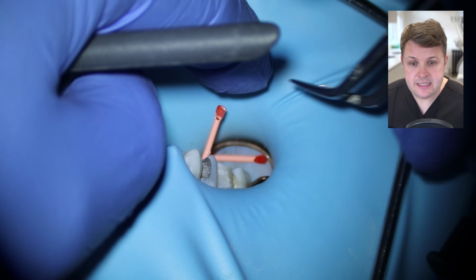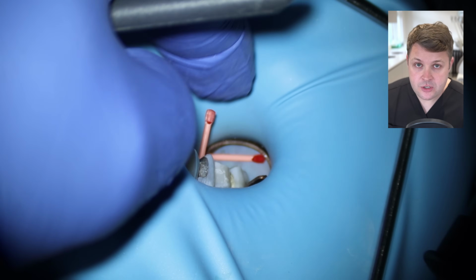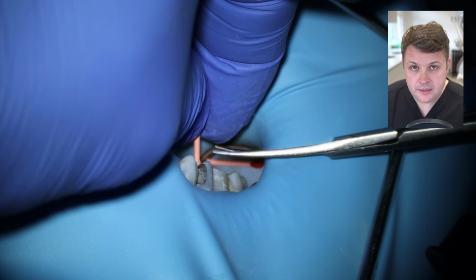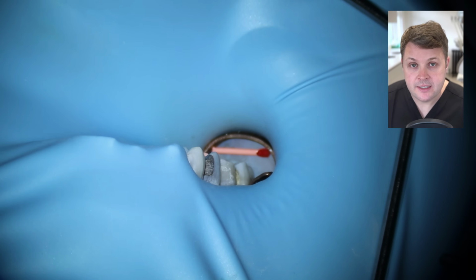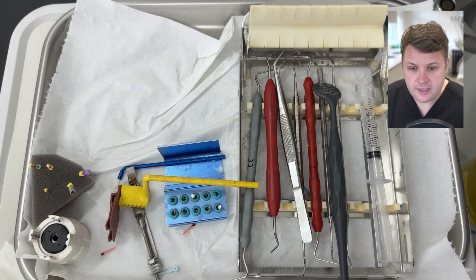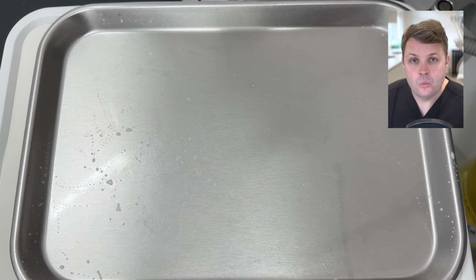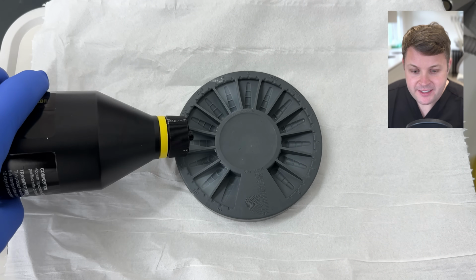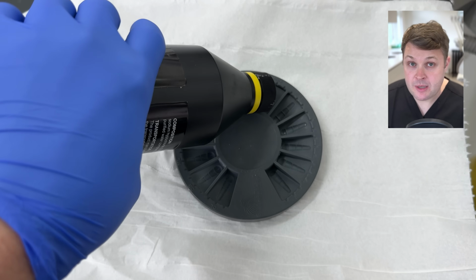And then when I place this GP cone to length, as I advance it into the palatal canal, I feel that this now reaches the correct point. And when we have a little feel of it, we can get a little bit of snugness there at the apical diameter, and then we snip the cone off, and we're going to take an X-ray. And while the X-ray is developing, I'm going to clean away my tray table because I'm ready to obturate.